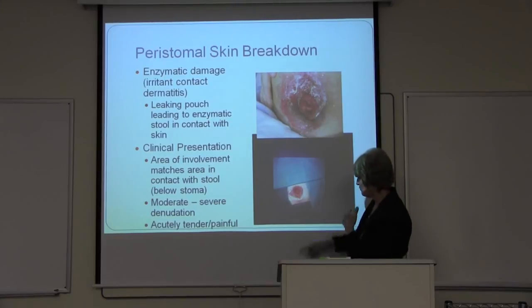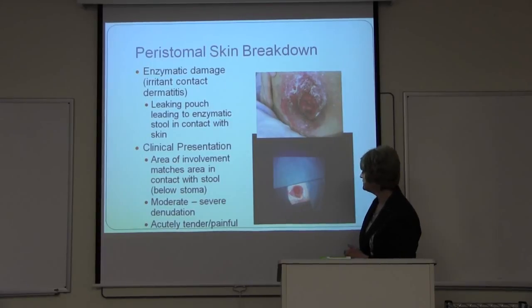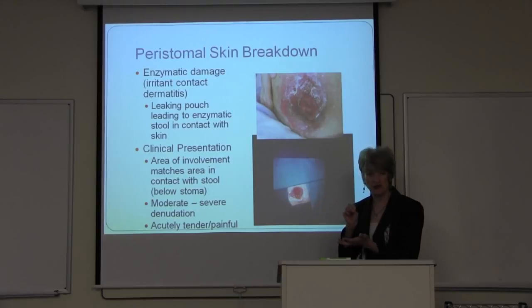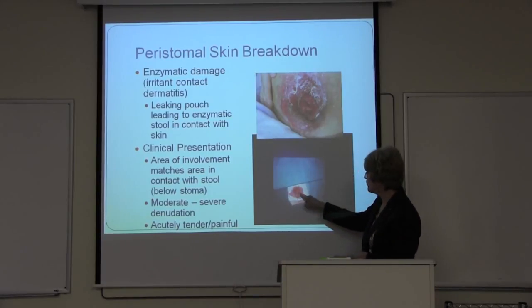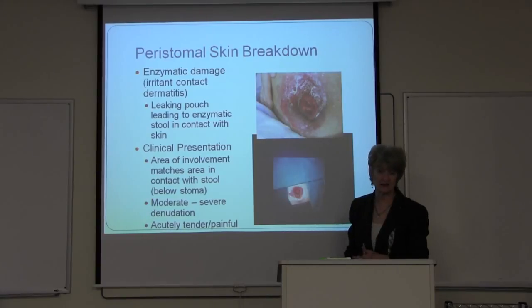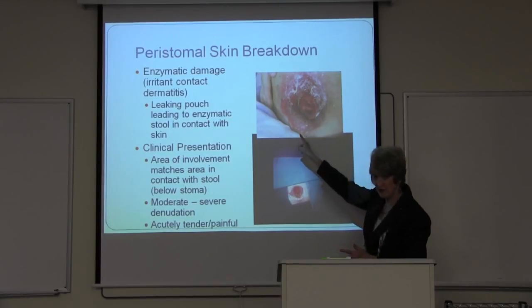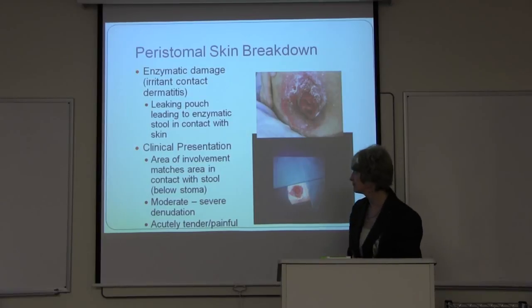This patient was 8 weeks post-op. What had happened was her stoma had shrunk down in height, and when she had peristaltic activity, the stoma literally pulled in. She emptied at skin level. So what we had to do for her was put her in a convex system. So this patient needed reduction of her prolapse and appropriate fitting of her pouch right around her stoma. This patient needed convexity.